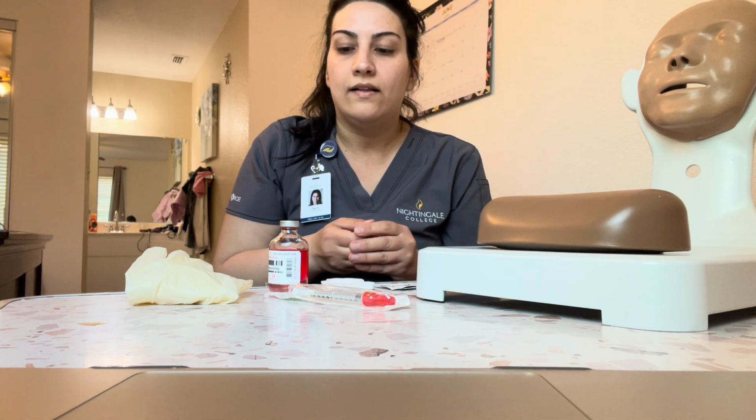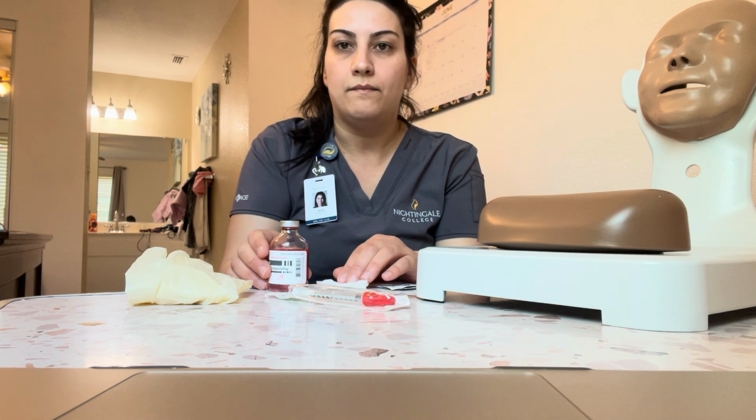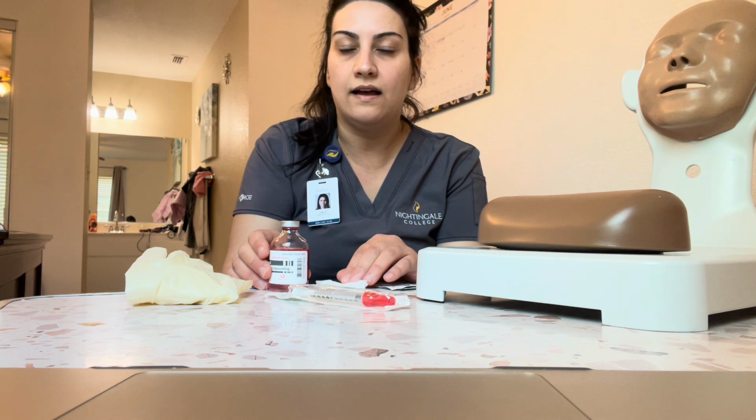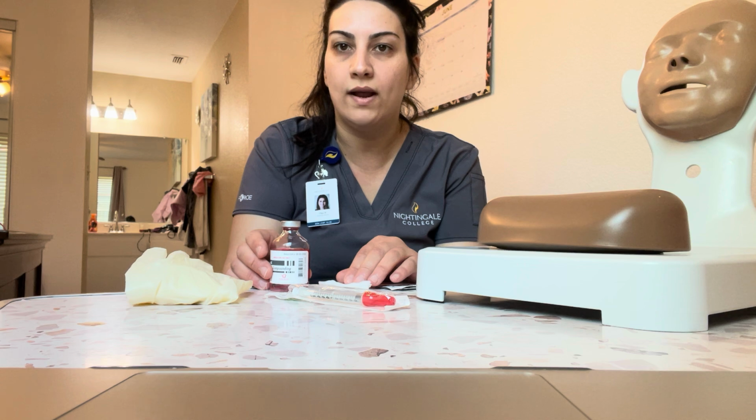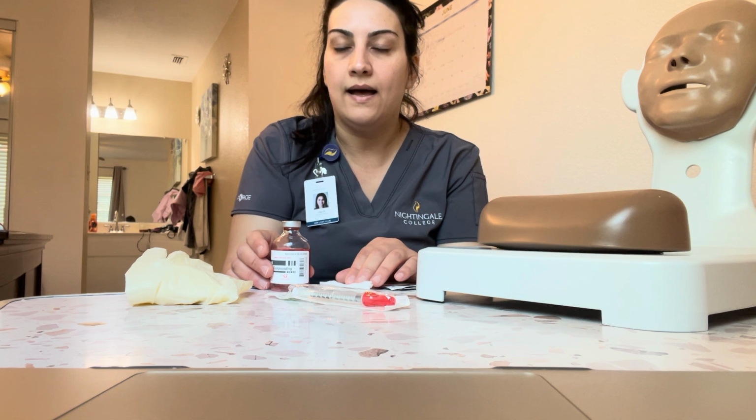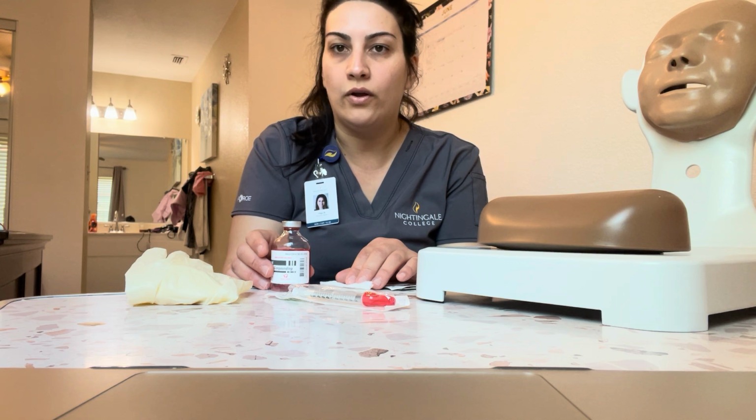Next, I'm going to calculate my drug. Basically, the patient is going to be receiving 0.1 milliliters per dose. What I have on hand is 5 tuberculin units per 0.1 milliliters. Again, the patient is going to be receiving a 0.1 milliliter dose. The medication that my patient is going to be given is called tuberculin purified protein derivative.